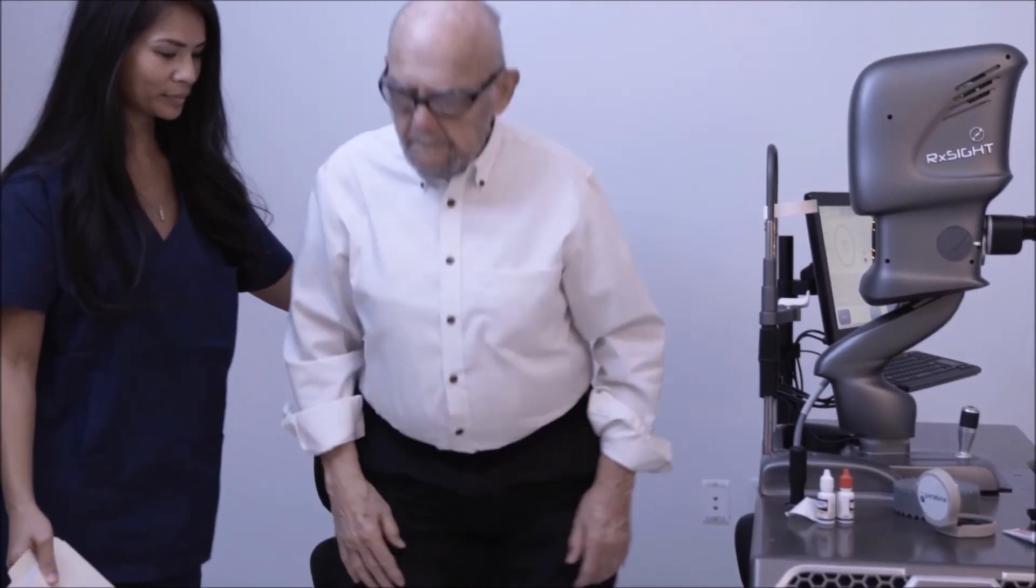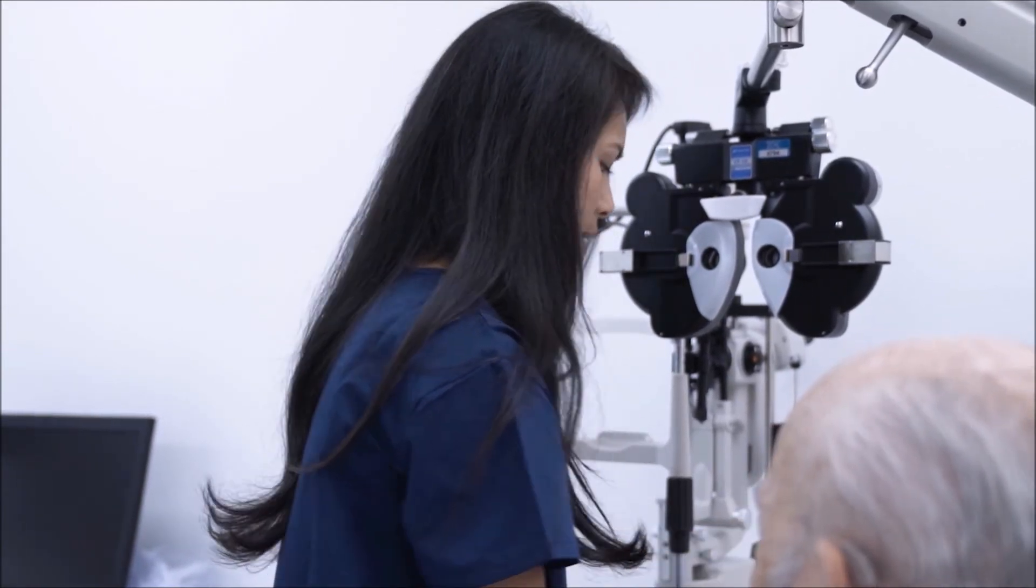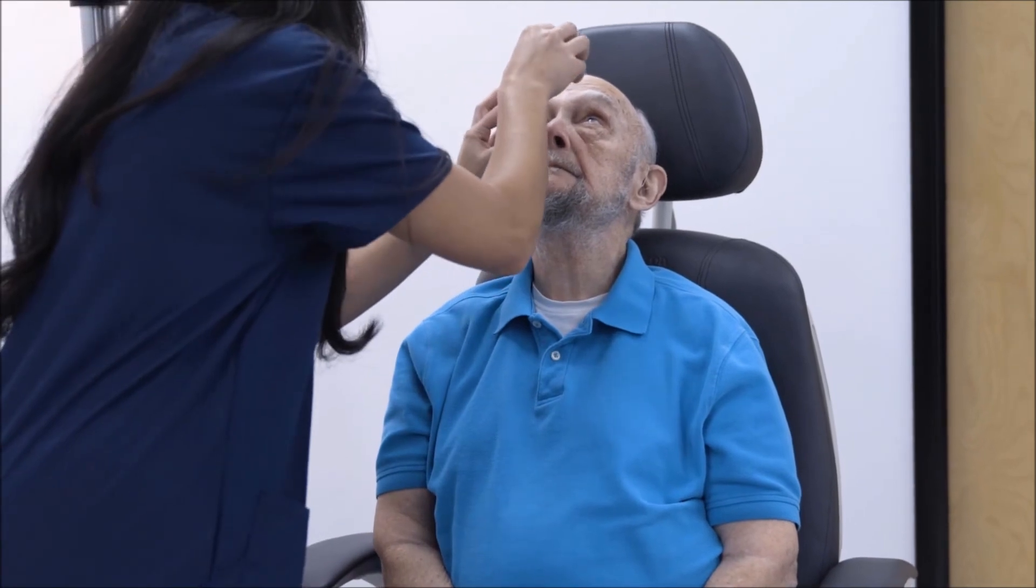Within 24 hours after the initial light treatment, the patient will likely observe a marked visual improvement. Upon returning to the office 3 to 7 days after the initial light treatment, the patient will have their vision re-evaluated, and if needed, the doctor can perform an additional adjustment.